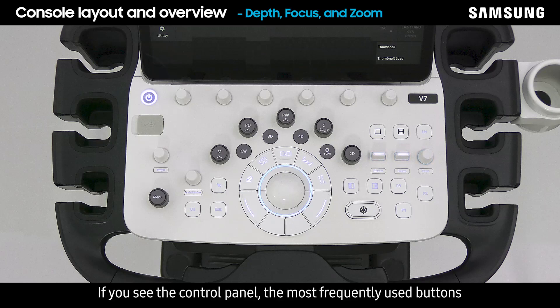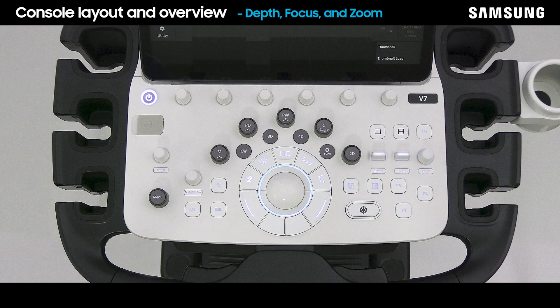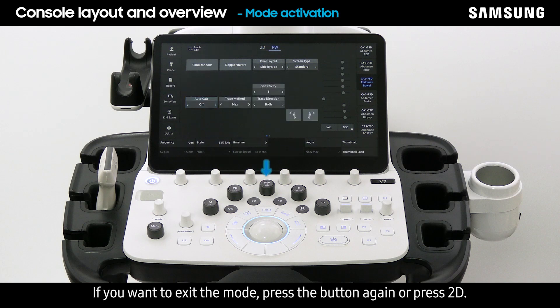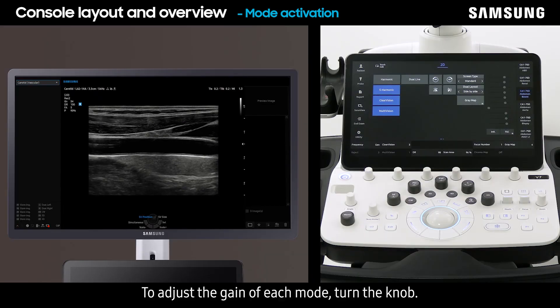On the control panel, the most frequently used buttons such as depth, focus, and zoom keys are positioned here. Activate modes by pressing each mode button. If you want to exit the mode, press the button again or press 2D. To adjust the gain of each mode, turn the knob.